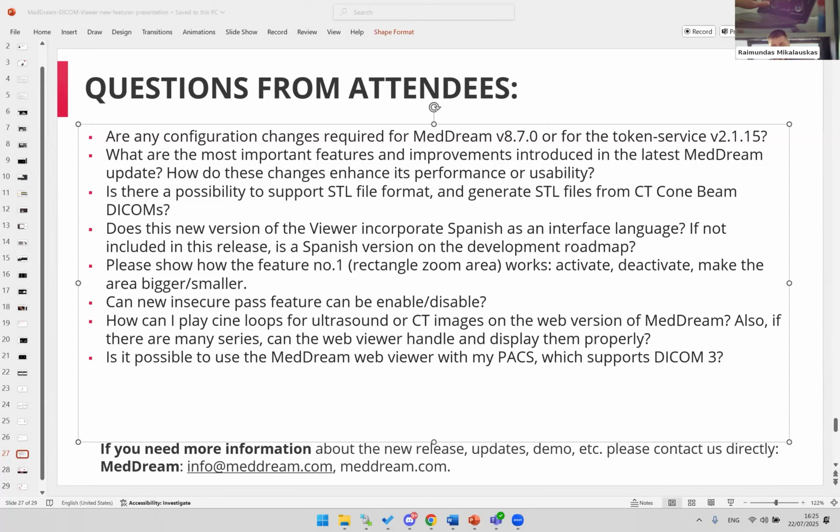In the future, we will think about the possibility to enable or disable it at all. But at the moment, we haven't done such behavior because first we need to analyze this, and the users and the clients should check and change these passwords, not to use things like demo or def or whatever test.